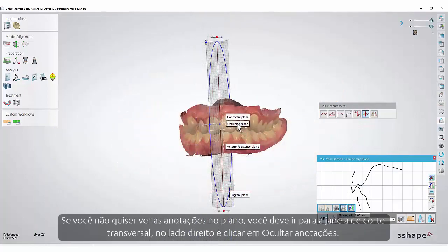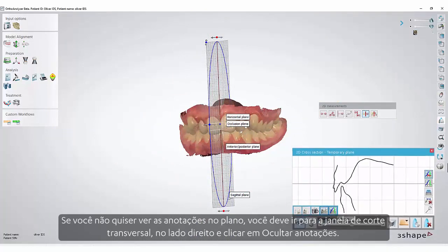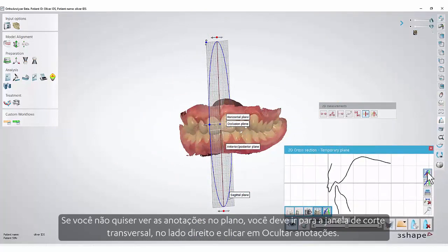If you don't want to see the annotations on the plane, you must go to the cross-section window on the right side and click Hide Annotations.